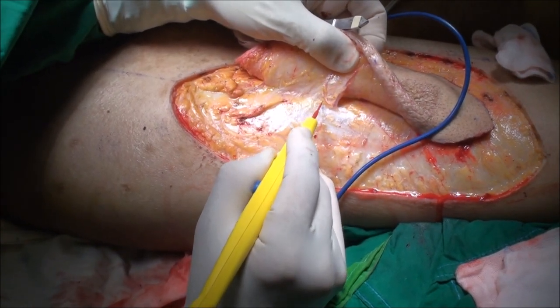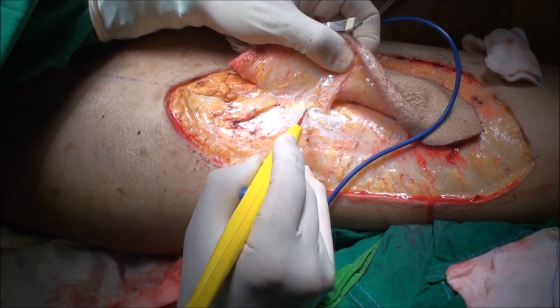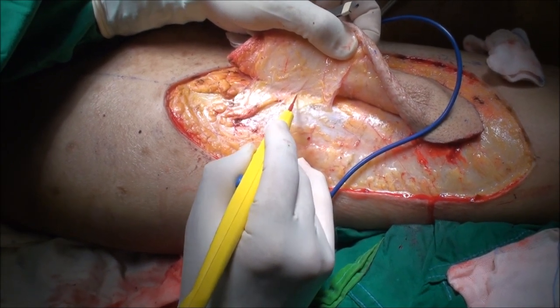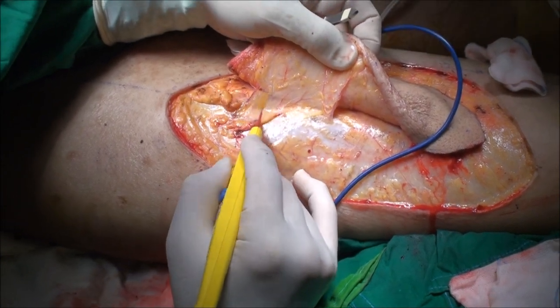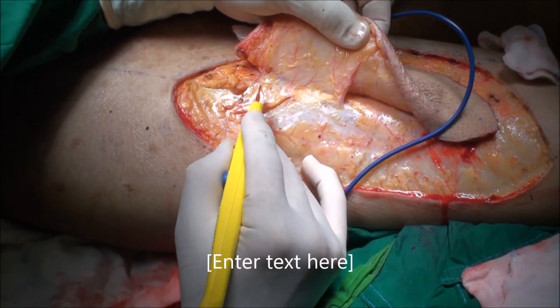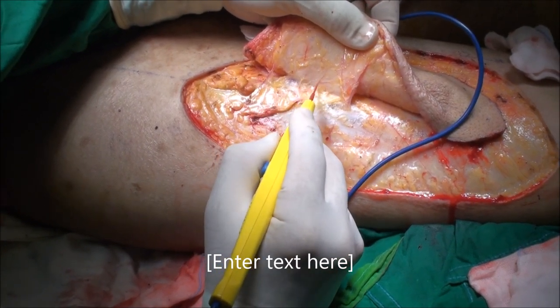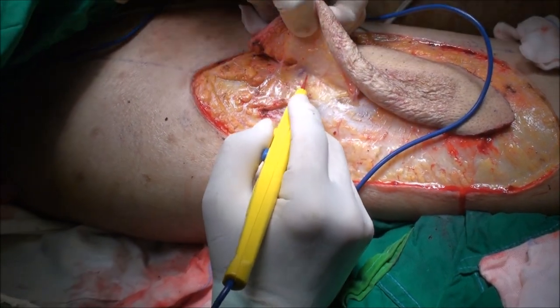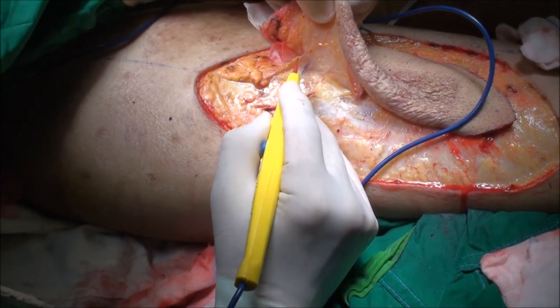Now note that we are dissecting within this fat layer and around the perforator piercing through the deep fascia. Traction is of most importance. The traction allows you to visualize the perforator while using this monopolar bovie on cutting mode. As you can see closely, we are not actually right next to the perforators — we are fairly close, but there is a good perivascular structure, and that is the target.